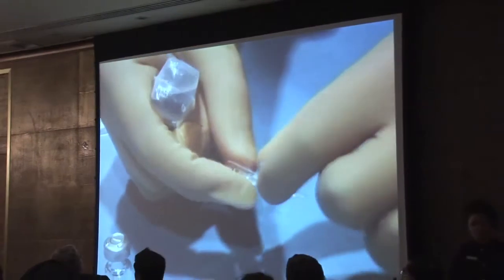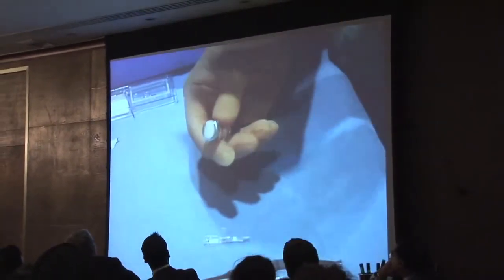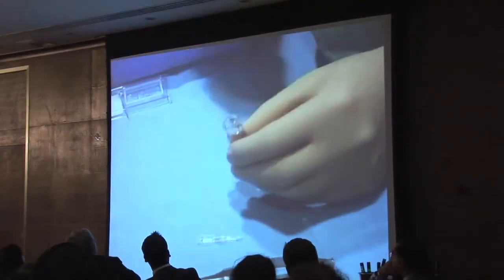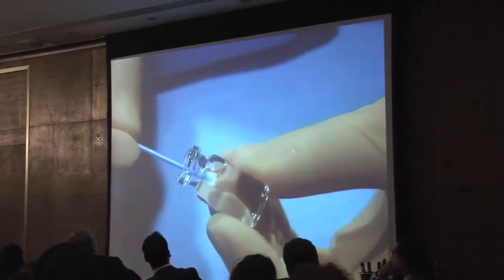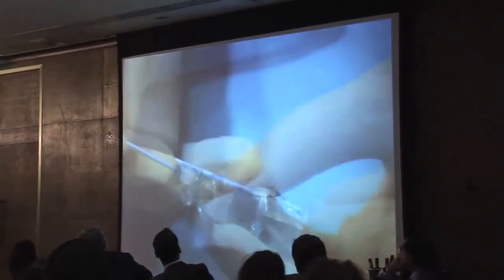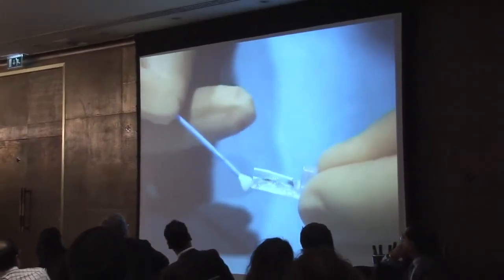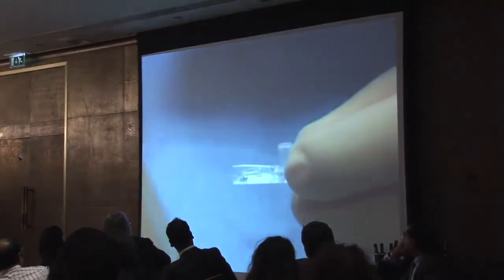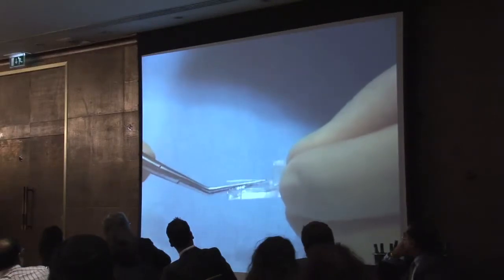So this is just a material to lubricate the cartridge so the lens can glide through. And with a soft plunger, the ICL is removed from the bottle. Now here you can see the lens. And it's a tiny little lens. The ICL is then positioned in the open end of the cartridge, and with the Vukic forceps, the lens is placed into the cartridge, pushed forward and tucked in.